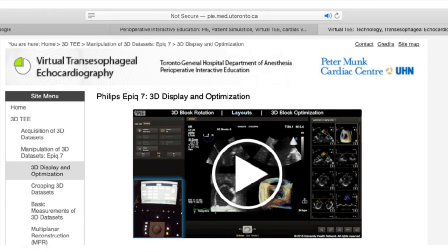We can also change the compression. Similarly to what you can do in 2D, you can actually change the compression, which allows you to increase the contrast of the different colors and shades used in the image. It's something that can further be done to optimize your image.